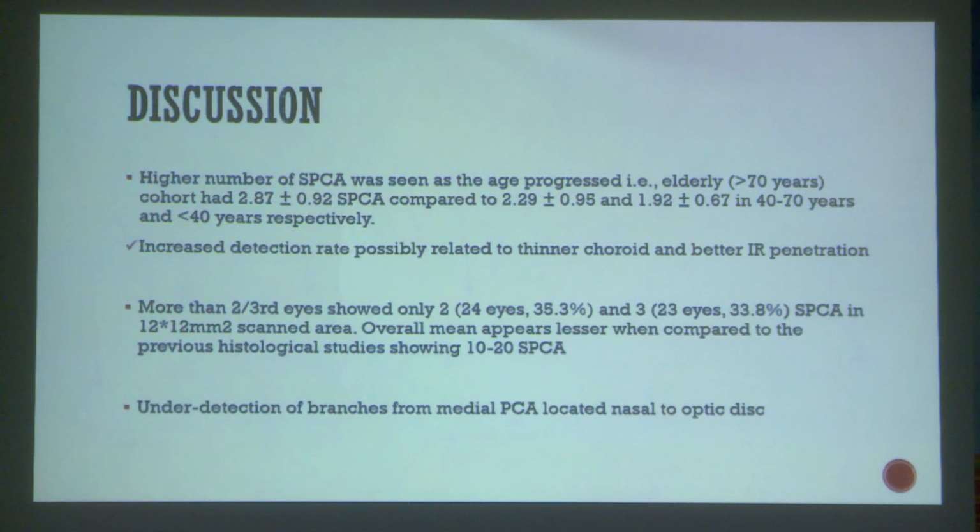This appears lesser when compared to the histological studies done in postmortem eyes by Hayreh et al., wherein they showed 10 to 20 SPCAs in the normal population. What we also missed could have been the medial PCA branches which are located nasal to the optic disc.